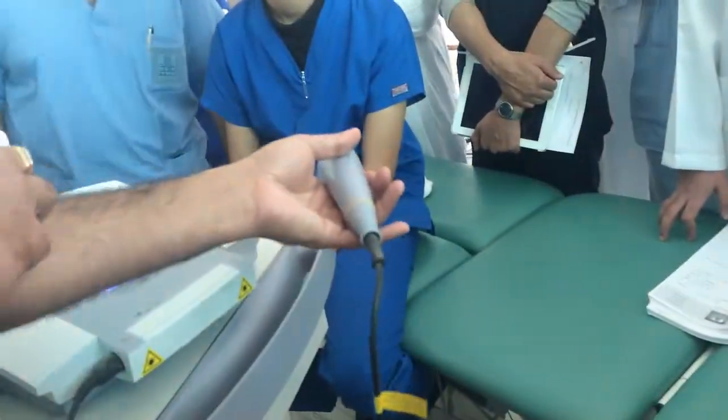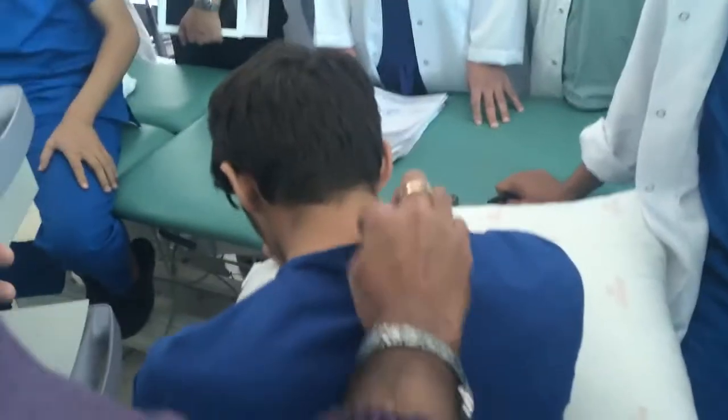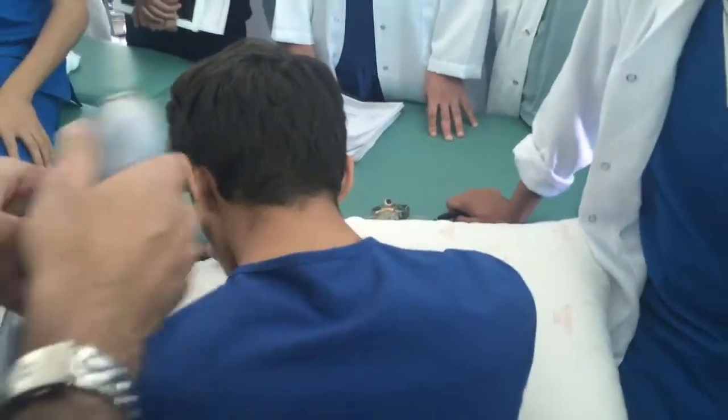Depending upon the area, for example he's having neck pain, this much area, so I have to use the scanning or grid technique. Grid means I am assuming this area as one small box. In that box, I'll be making small boxes and I'll put this here, nothing will happen.